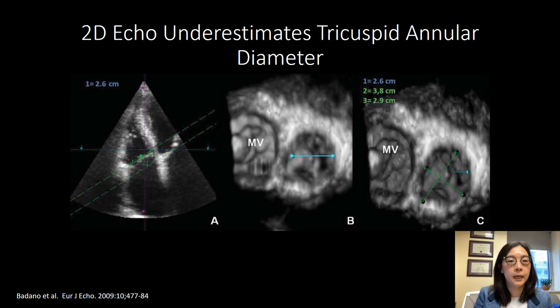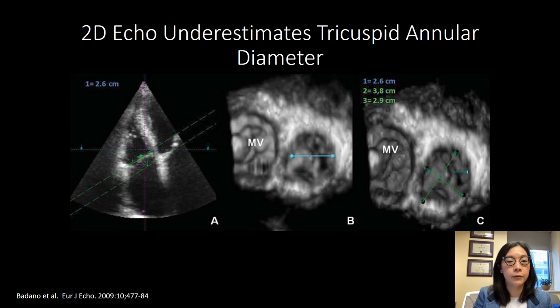3D has also improved our understanding of how much we underestimate tricuspid annular measurements from a four-chamber view. Typically these measurements are done in the OR to decide whether or not the tricuspid valve should be repaired at the time of mitral valve surgery, regardless of the amount of tricuspid regurgitation present. Here you can see that a four-chamber view and the 3D cut plane matching that view are not cutting at the longest dimension of the tricuspid annulus, and so we're underestimating how big it actually is.